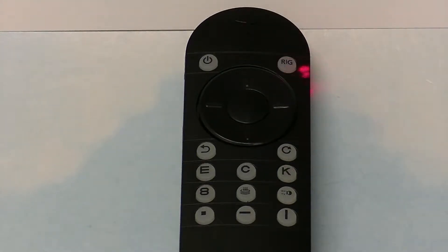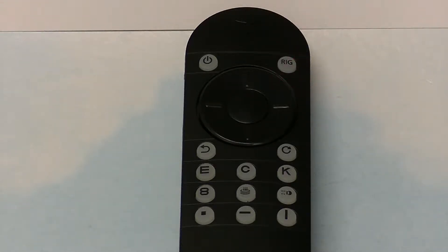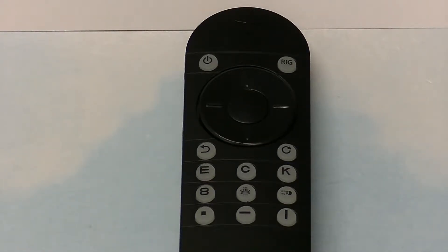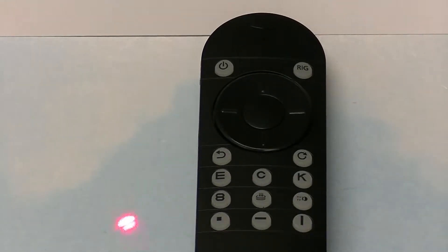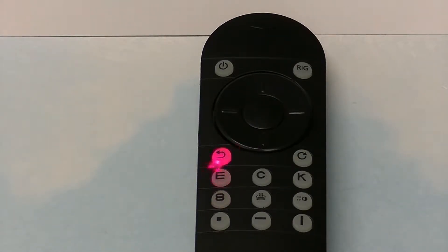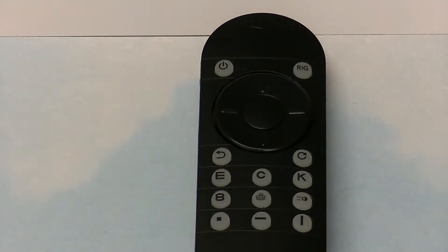This button right here says RG. What that does is it puts a red-green slide over every slide, so you can have a red-green image to do your acuities and your refractions. The next button down has the left arrow rewind button on it, and what that does is it allows you to return back to the previous menu.